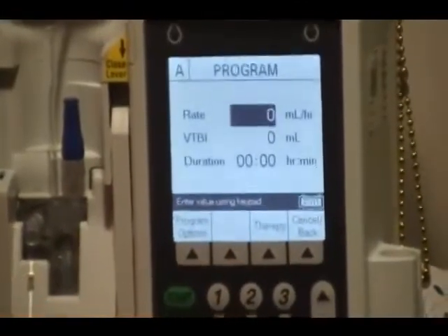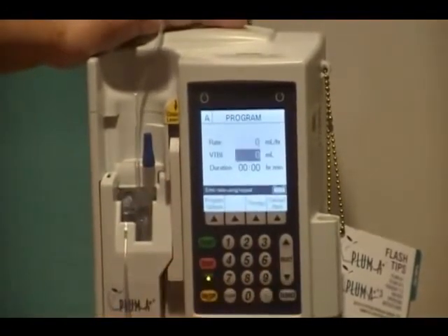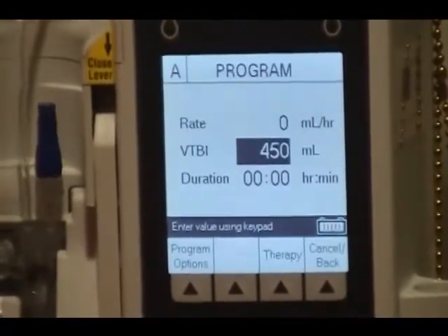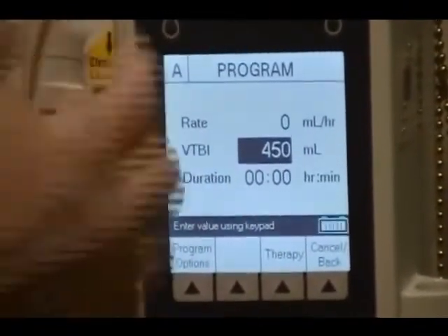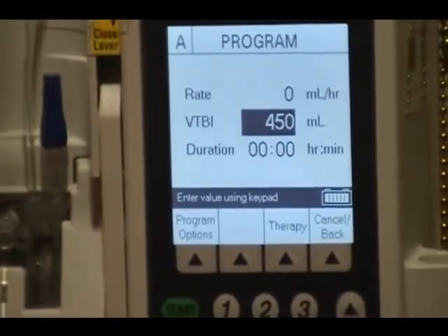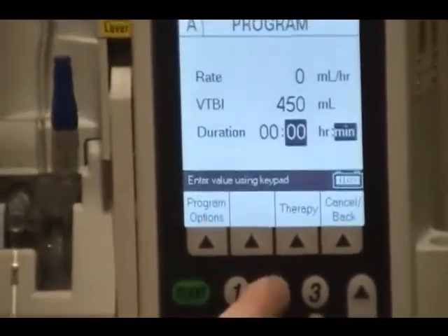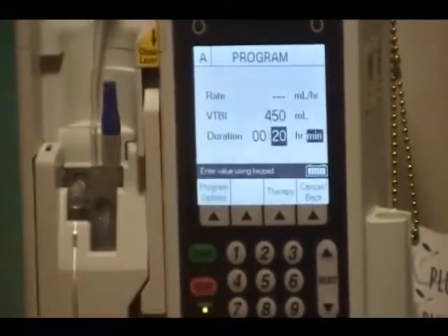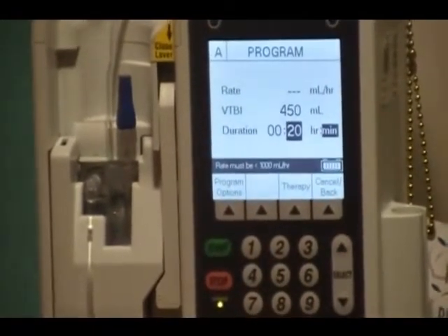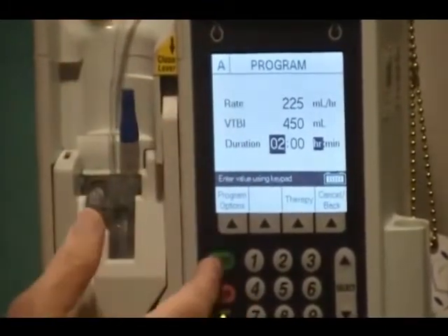Here's Line A and it's going to ask me the rate. If I wanted to run it at 100 or 150, depending on what the doctor said, I'd enter that rate. Then I'd put in my volume — I'm going to say 450 because we've primed it. Say the doctor wants it up and running over 20 minutes: I move down to the duration field, select minutes, and enter 20 minutes. It doesn't give you a rate because that would be too high for the pump — the pump won't go higher than 999. So let me go back, clear this, and say I want it to go over two hours — then it tells me it would run at 225 an hour. So then I start it.